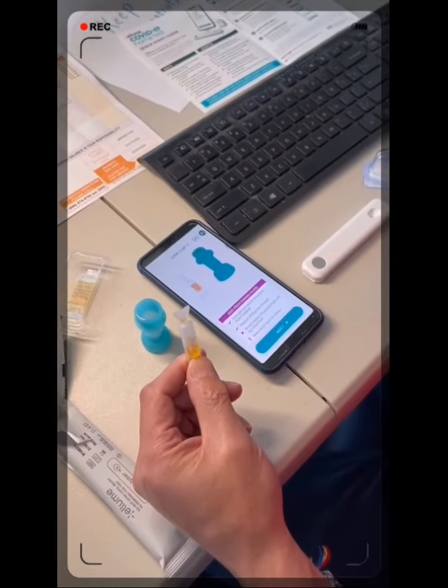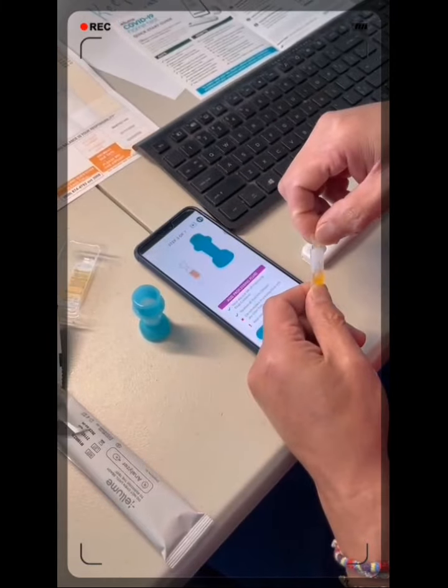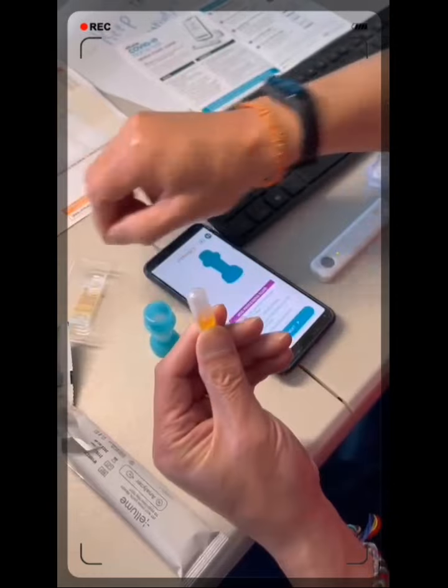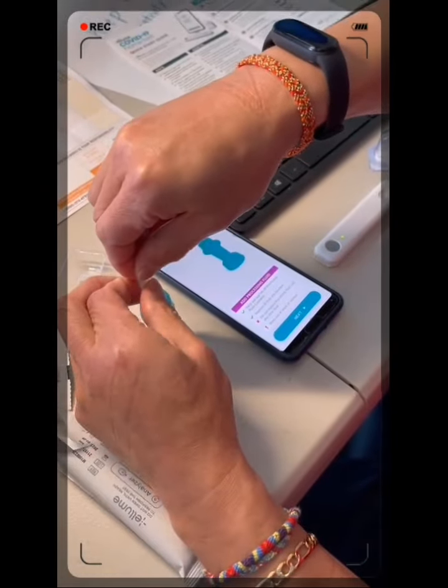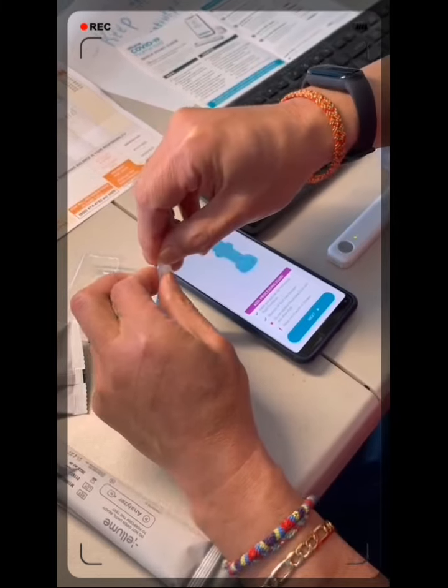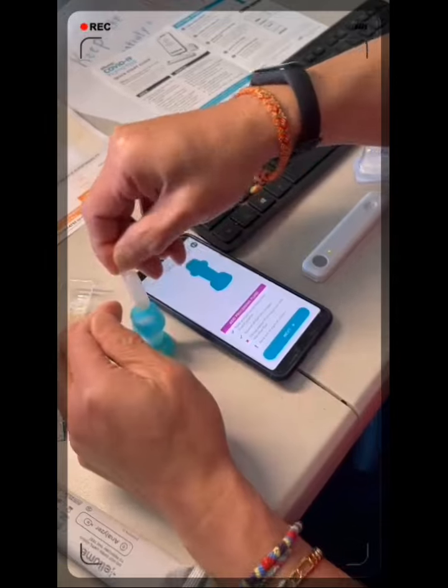Twist and pull. Twist and pull — drop the contents all in. I think that's good enough.